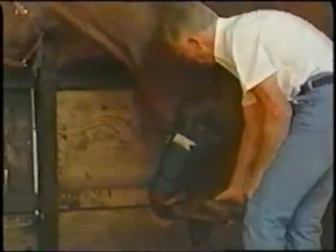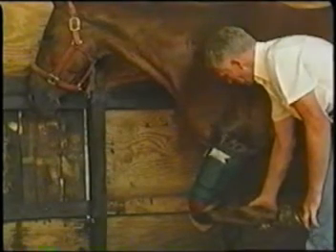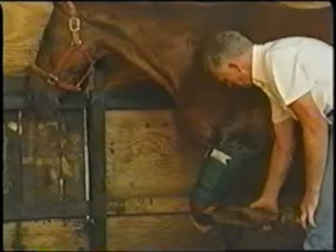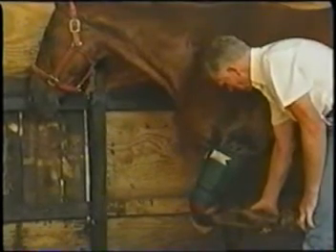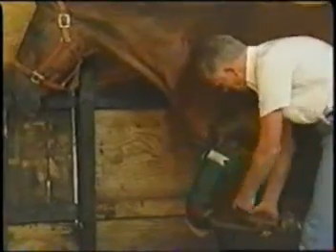Now you can see how much, now that the weight of the horse is no longer on the leg, preventing movement, you can see how much those muscles are moving. You can see them twitching the leg, and you can imagine how much the circulation is stimulated tremendously. It's not a matter of increasing circulation 100%. It is likely that the circulation is increased by 1,000%. In other words, it's 10 times normal.